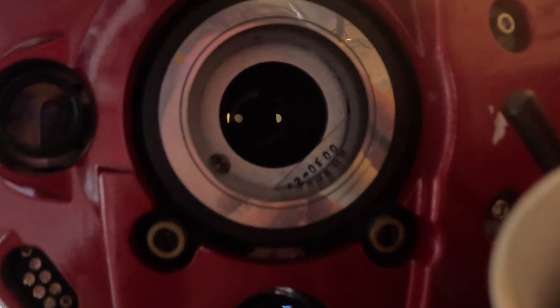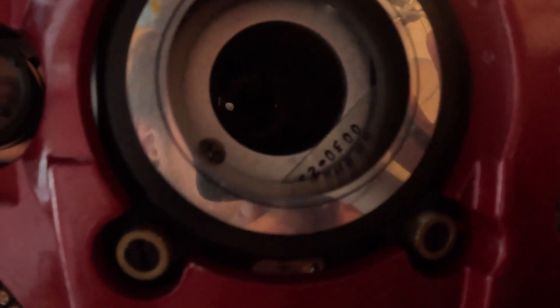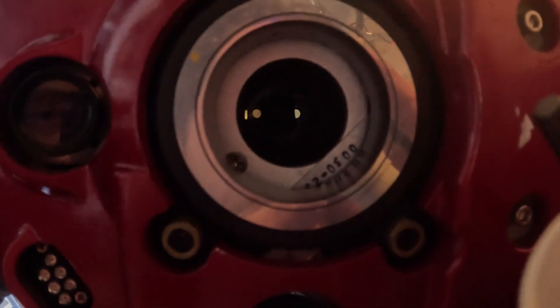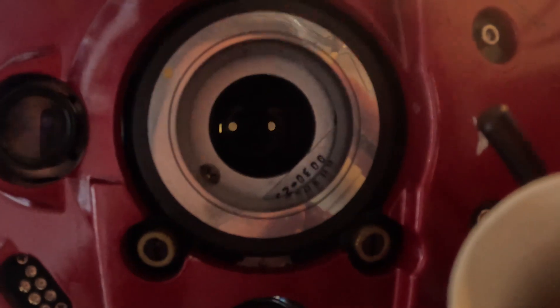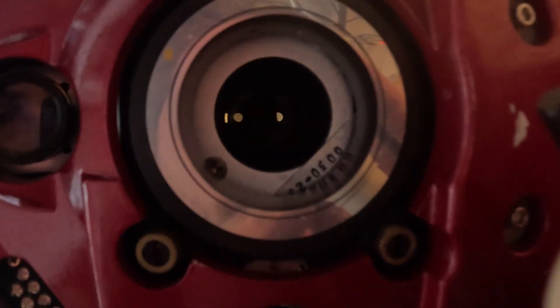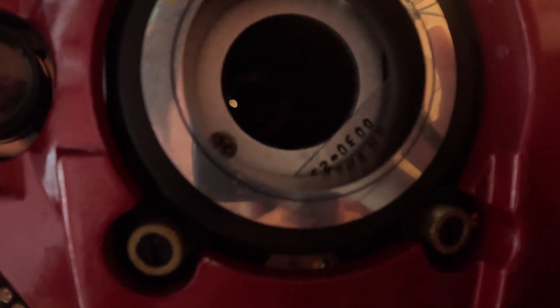It's about a minute per eye — roughly 10 seconds per diopter. So if you're a minus three prescription, it's about 30 seconds per eye. If it's a plus prescription, a little bit longer — like plus two is about 40 seconds. Unless you have a really bad prescription, it's going to be less than a minute, and I'm sure you can do it. Just practice doing it now.